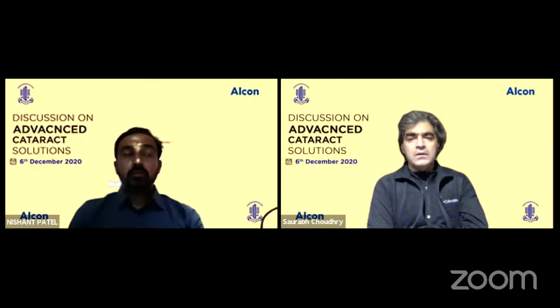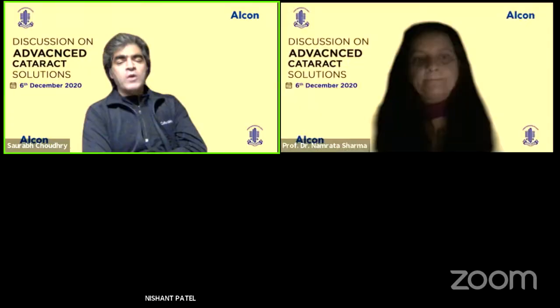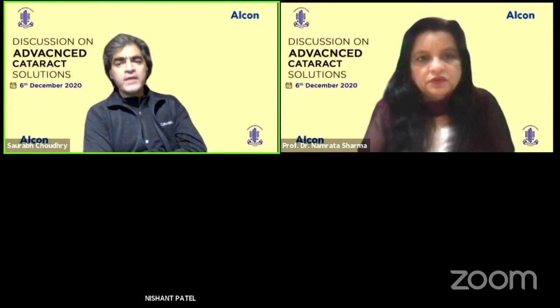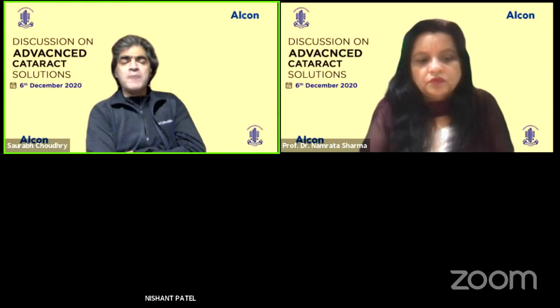Okay, and Dr. G.S. Dhami sir is asking a question, which is very pertinent: what would be your threshold for astigmatism when you are giving a trifocal lens? Saurabh, would you want to answer that, and then we can take Dr. Nishant's comments? I would use a PanOptix toric in case it is required, in any case above 0.75 diopters, if I'm putting a trifocal or a quadrifocal lens like the PanOptix. But if the patient has 0.75, I would still want to put a simple PanOptix. So that's my threshold.